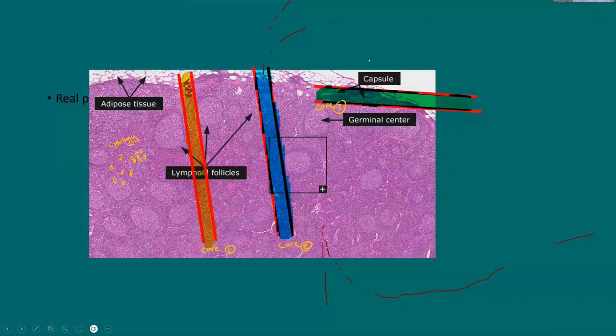When we talk about lymph node core biopsies, it's important to assess the adequacy of the cores, and you can imagine this is just a theoretical core biopsy through the lymph node that I showed you earlier. So if we've taken cytology, we are just sampling multiple tissues from multiple areas of the lymph node. But if we've taken core 1 biopsy, for example, we will just be sampling the interfollicular areas only, without much architecture of the follicles to see.